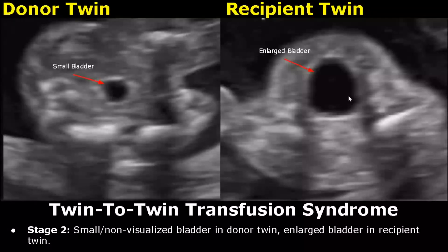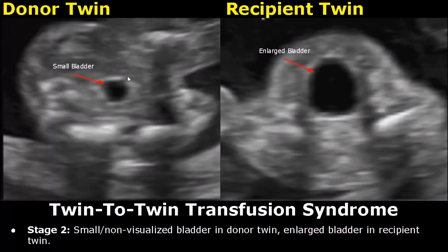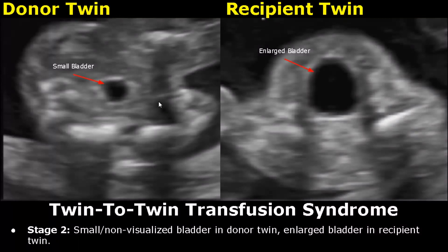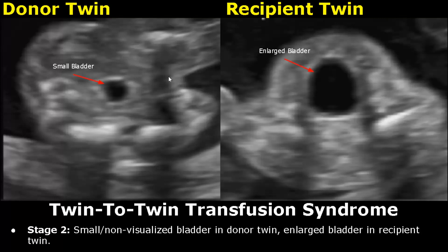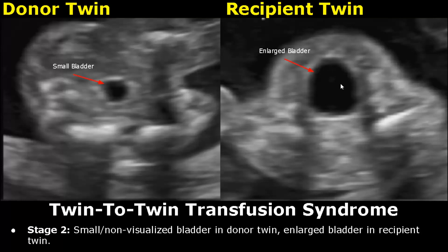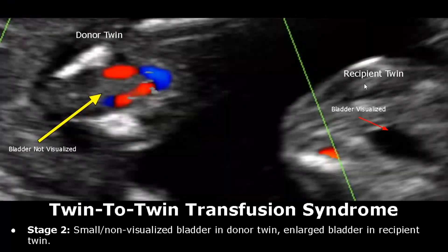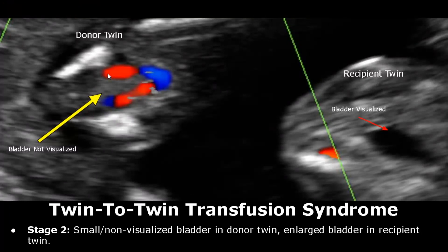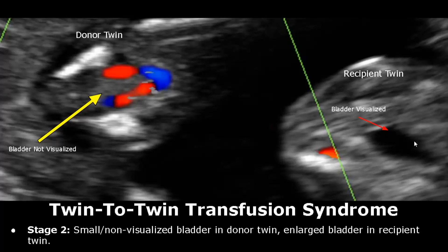In stage 2, the donor twin will have a small or non-visualized bladder, in association with oligohydramnios. The recipient twin will have an enlarged bladder along with polyhydramnios. Here is another image showing non-visualization of the bladder in the donor twin and visualization of the bladder in the recipient twin.